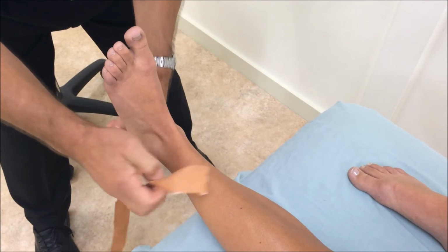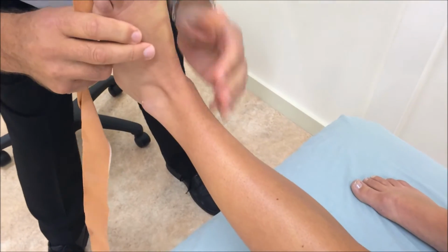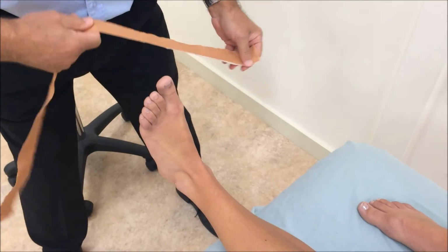The only other thing we need to do then is look around the back of the Achilles and around the tape for any pieces of skin that are poking through, and put some tape over them to protect from blistering or tape cuts. So now we'll dispense with the practice tape and I'll demonstrate an ankle strapping in real time.